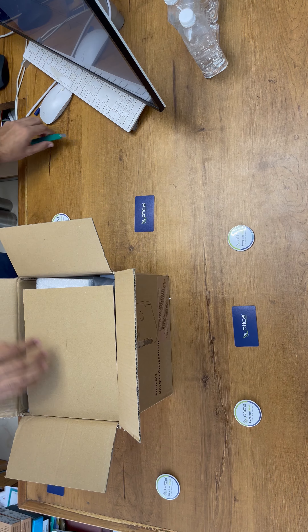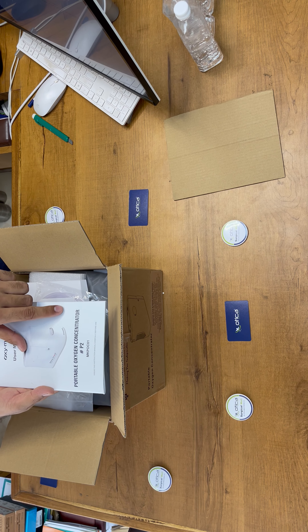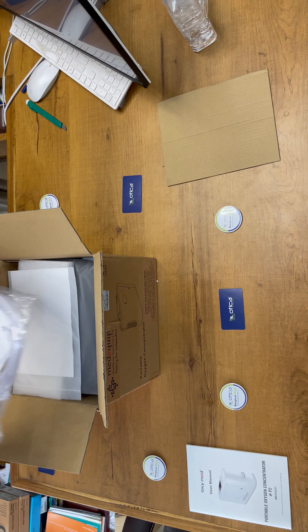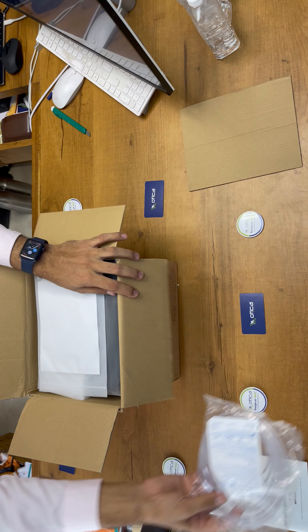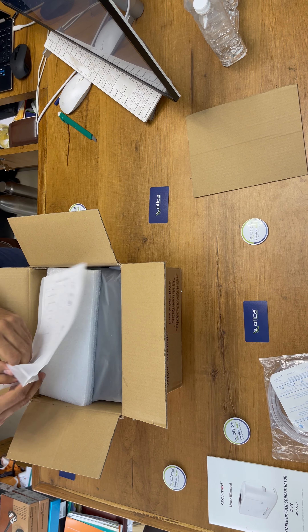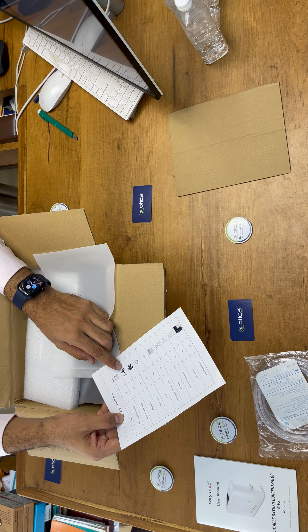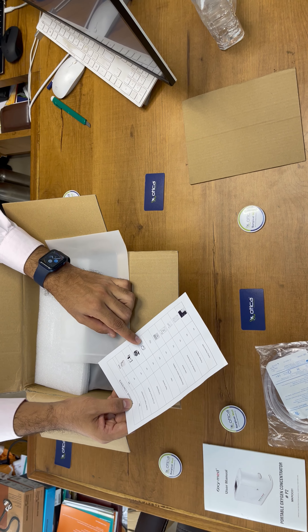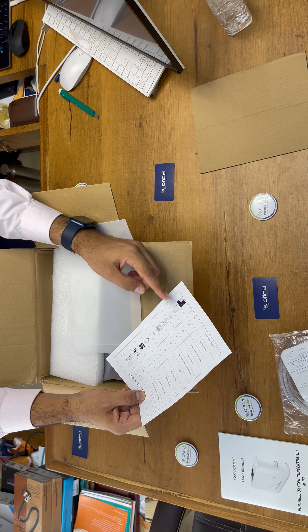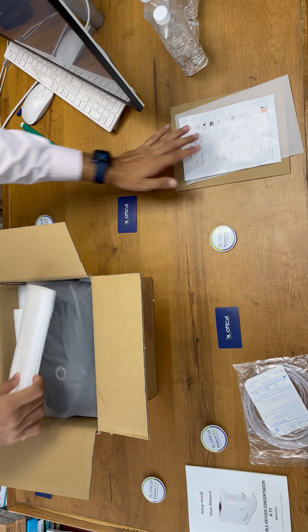First of all, as you can see, there is one user manual. This machine is a very good machine. This is the portable oxygen concentrator P2 model made by OxyMed — this is the user booklet. Then this is the nasal cannula; they give a 2-meter nasal cannula along with the machine. The packing contents include: portable oxygen concentrator, AC power adapter, carrying bag, nasal cannula, filters, rechargeable battery, and user manual.